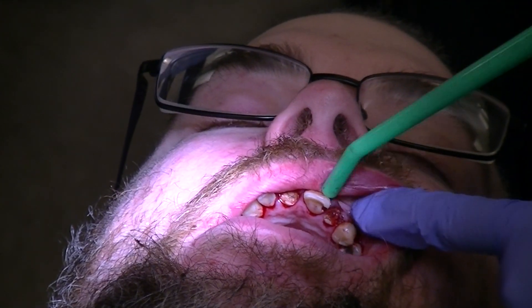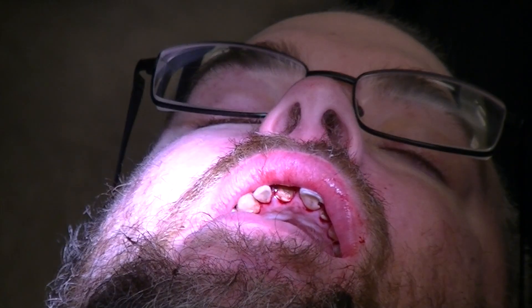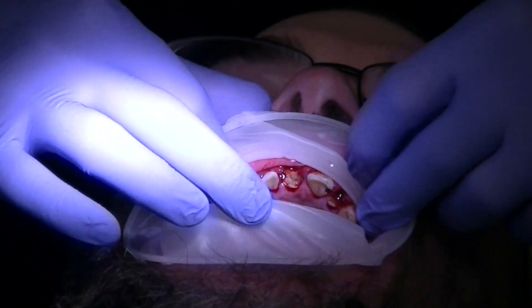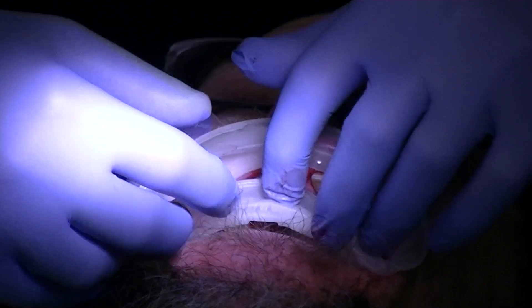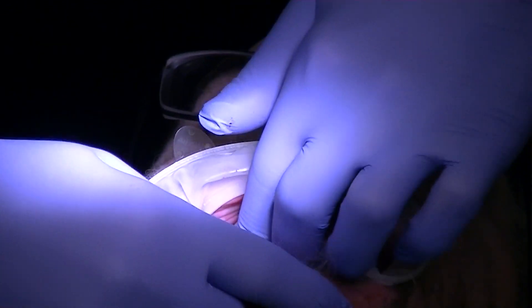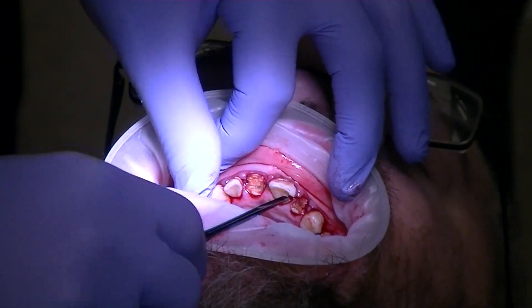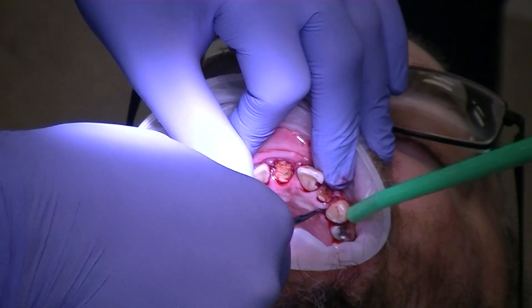Let's see if we can get something on there. Let's see if this opter gate fits so everybody can see. I'm going to try and put this device in — it just stretches your lips. It's like putting a washer in your mouth. Everybody see a little better? Now let's go from the lingual — open up — and see if we can get some movement.